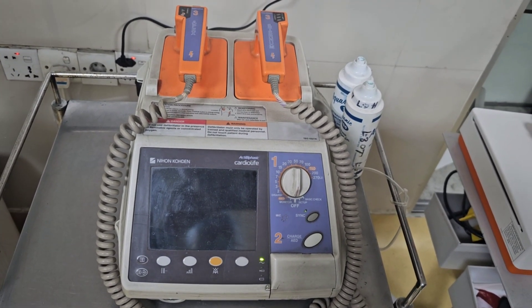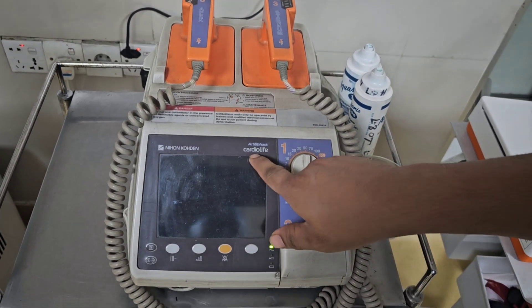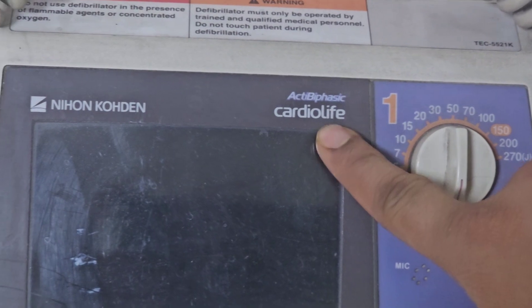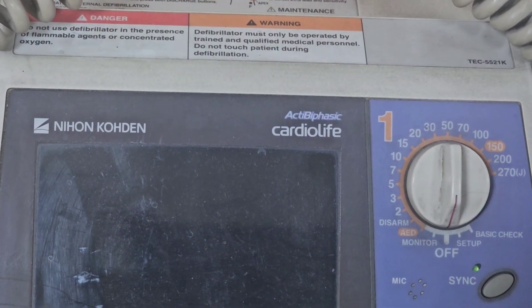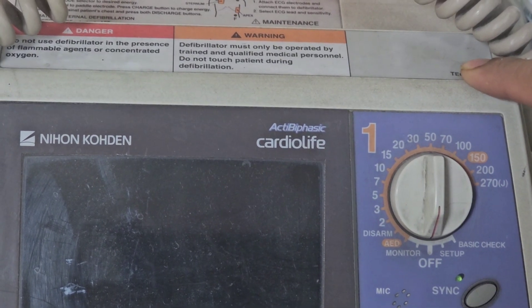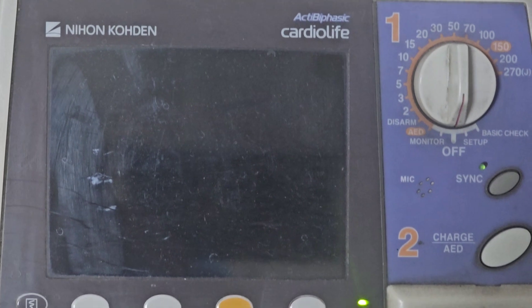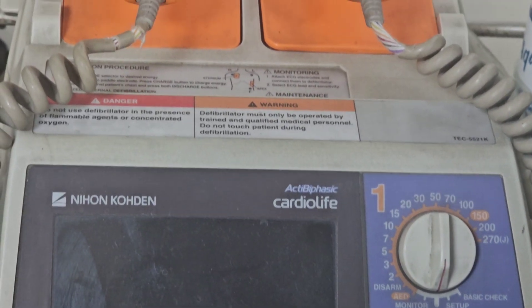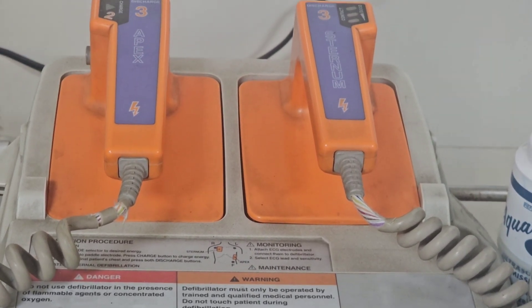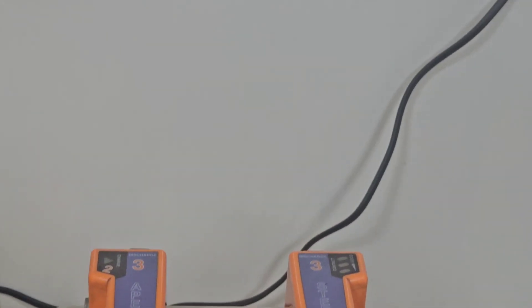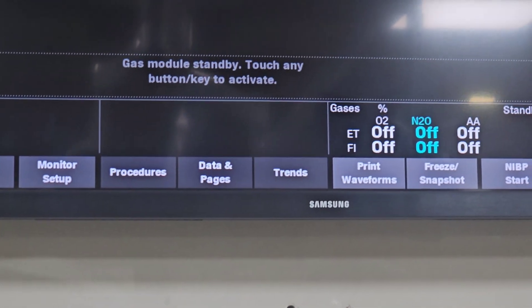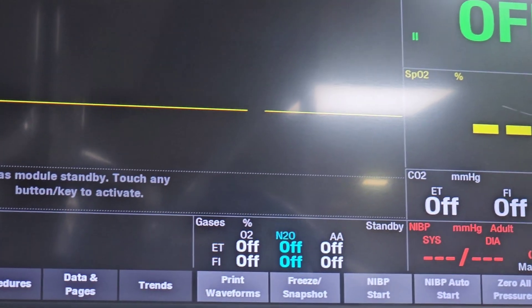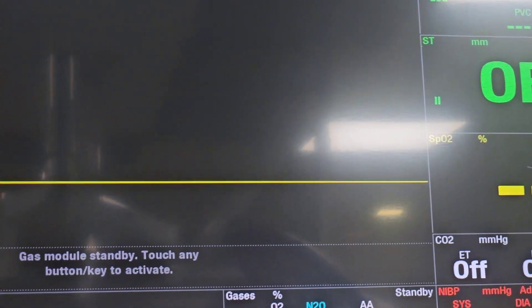We are seeing that this is a Cardio Life — that is the brand name of this machine — and it is an active biphasic type. We know there are two types of defibrillator: one is monophasic and one is biphasic. Both of them are available in different parts of our medical sector. There is a lower energy requirement in the biphasic defibrillator, and we can use it in our OT, ICU, or emergency department.